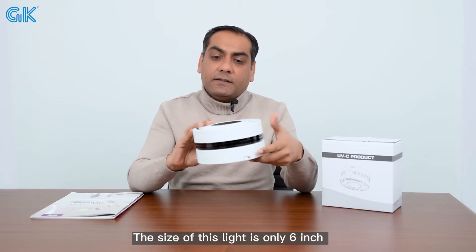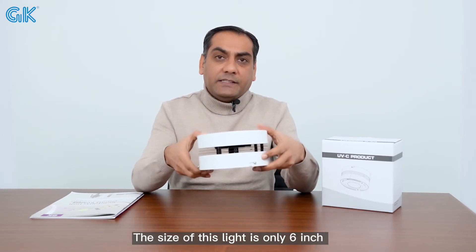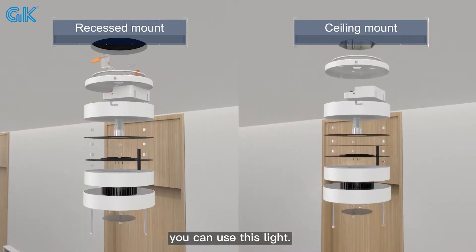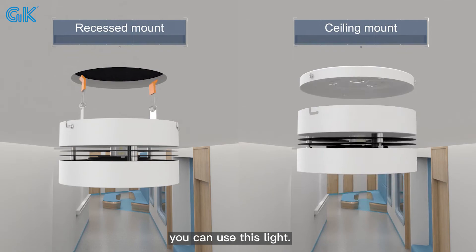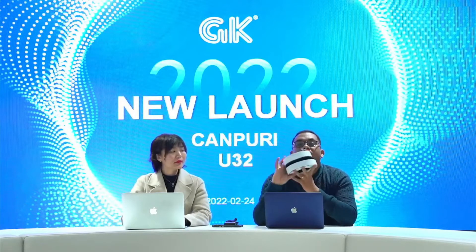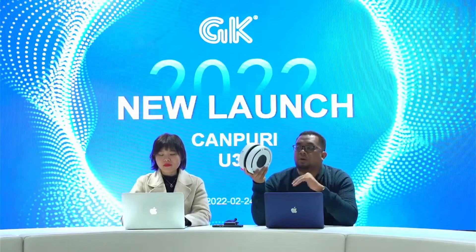Fresh air comes out from here, so air circulation keeps the environment clean and safe. The size of this light is only 6 inches. You can use this device on surfaces, and it works both ways. It uses a UV LED chip inside for upper-air installation, with two options: surface mount and recessed.